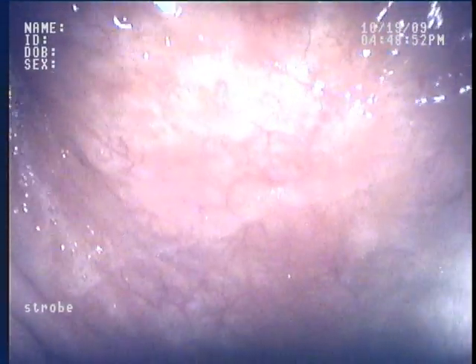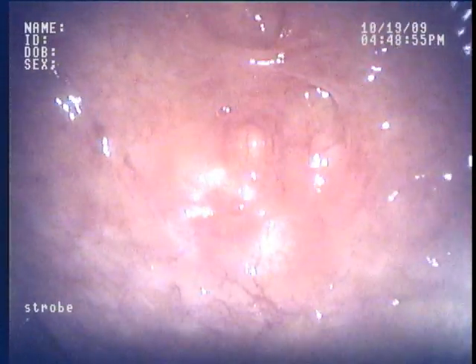This area here is the back of the nose, known as the nasopharynx. The adenoids usually live here, but in an adult they're absent.